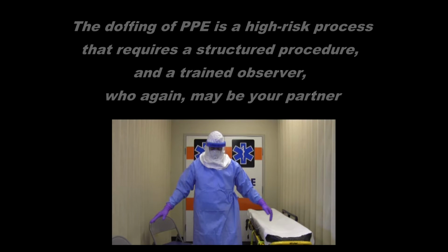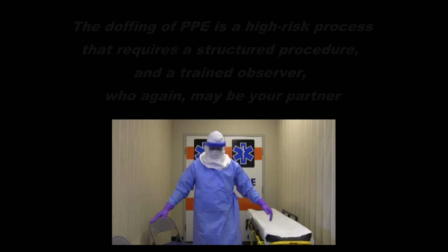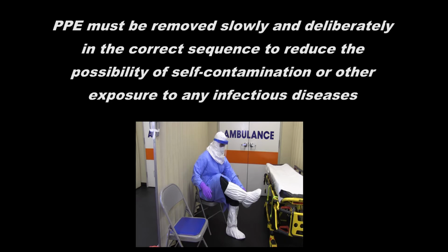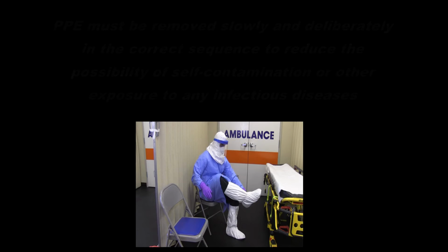Once patient care is complete, you will then need to remove or doff your PPE. The doffing of PPE is a high-risk process that requires a structured procedure and a trained observer, who again may be your partner. PPE must be removed slowly and deliberately and in the correct sequence to reduce the possibility of self-contamination or other exposure to any infectious diseases.